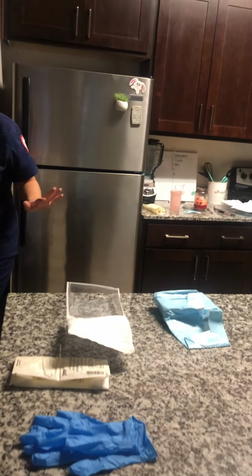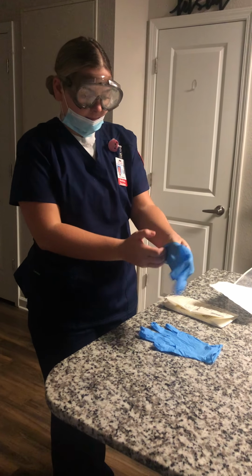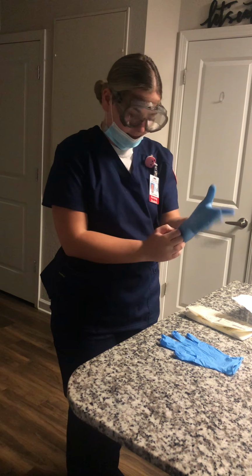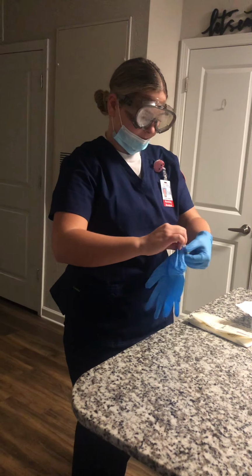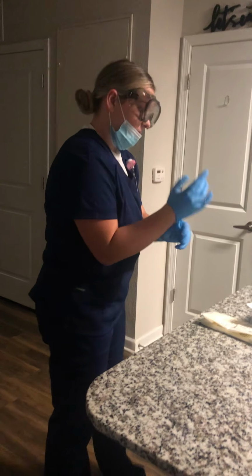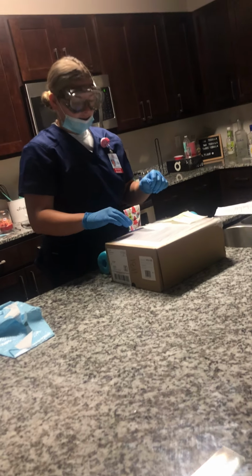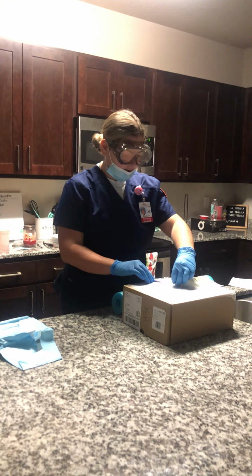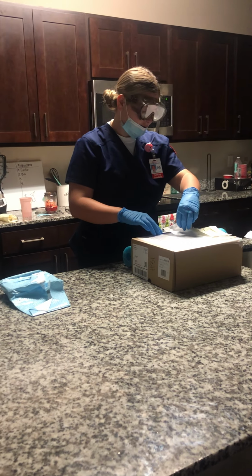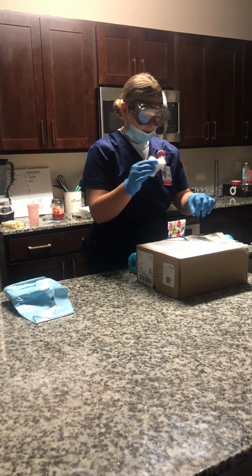So being careful not to turn my back to my patient, I'm going to come over here and I'm going to apply my clean gloves. And since these are my clean gloves, I can fix it. So after my clean gloves, I'm going to come over here, and I'm stabilizing the catheter, and I'm also removing his old dressing. So you want to remove it towards the catheter insertion site. So I'm going towards the insertion site, so I did do that. So now I have his old dressing.